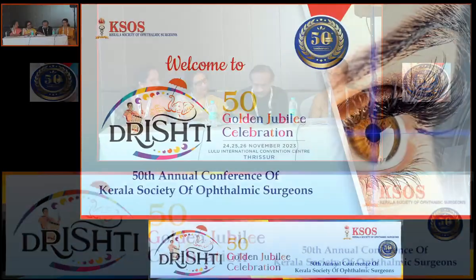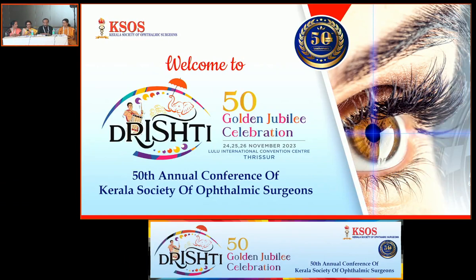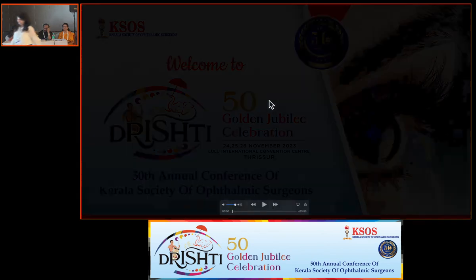Next, we have Dr. Sanjana. She is a cornea surgeon working in Agarwal's Eye Hospital, Kochi. She will be talking on the use of rust removal bar for corneal foreign body removal. Over to Dr. Sanjana. So it's a complete 4-minute video. So once that is done, we can do the discussion.